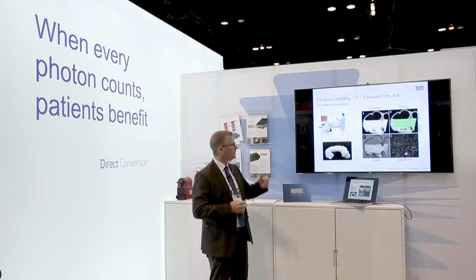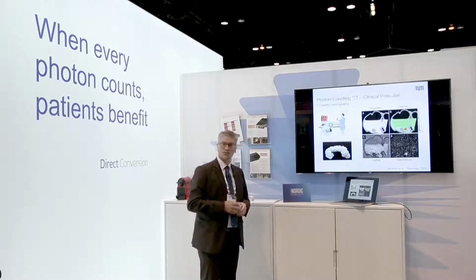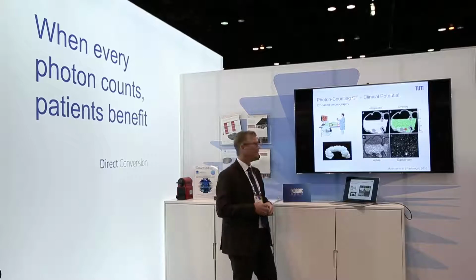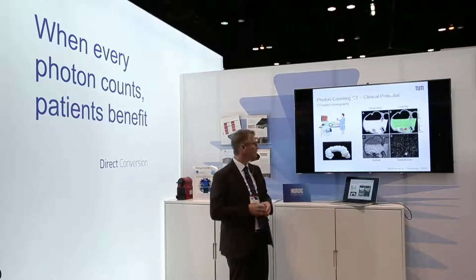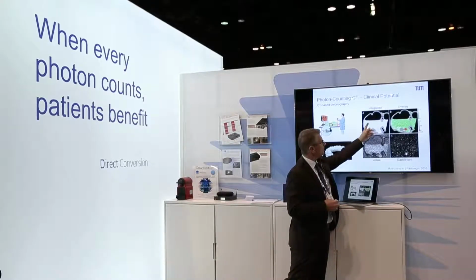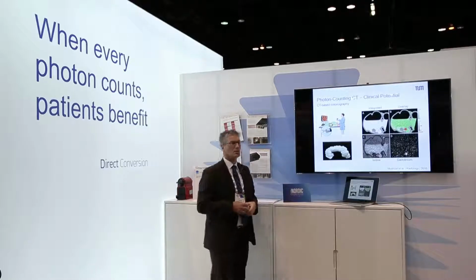Good, this has actually been investigated by several preclinical scanners that have been built over the course of the last few years. One suggestion is about CT-based colonography. You know, colonoscopy is usually an interventional procedure where you insert an endoscope. That's not very comfortable, so you can also do a CT-based colonography screening, and that basically means that you give the patient some contrast agent to drink, and if this would be the bowel, you see that this contrast agent enhances the inner part.